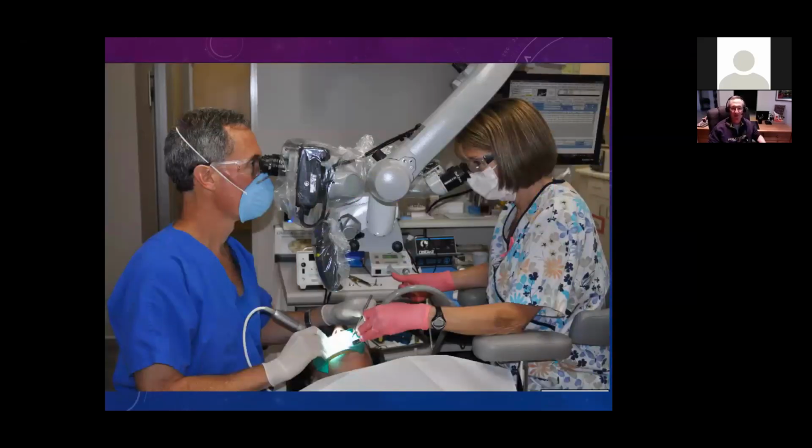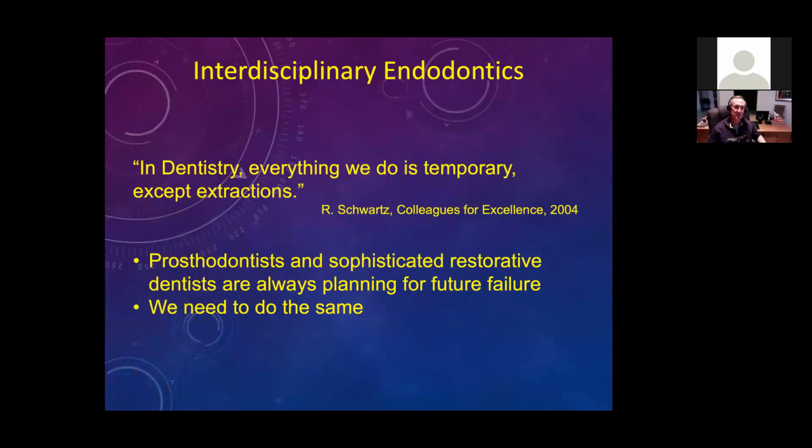Whenever you're an endodontist, you have to show a picture of yourself working under the microscope. So here's mine. A couple things you might notice about how we do things. Both my assistants and I have armrests for stability. We photograph a lot of the work that we do and use it in lectures and in patient education. I have my oculars that I work with. My assistant has her oculars, so she can see exactly what I'm seeing. It's particularly helpful. We do a lot of restorative, a lot of the initial restorative in our practice. We do a little bit of surgery, and mostly just conventional root canal treatment. It's very helpful having your assistant being able to see what you see.